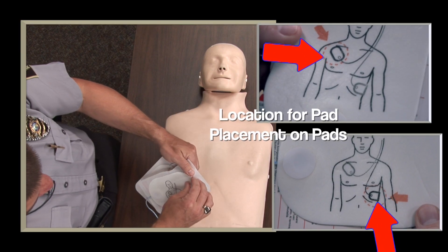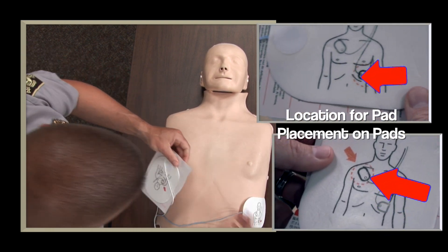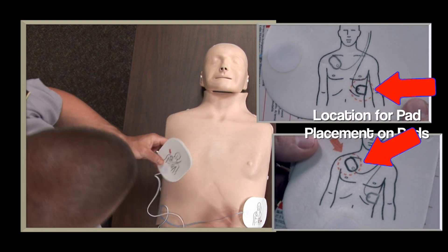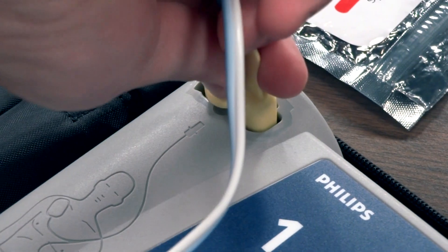Apply pads to patient's bare chest. Plug the pads connector in next to the flashing light. Plug the connector into the AED and follow the prompts.